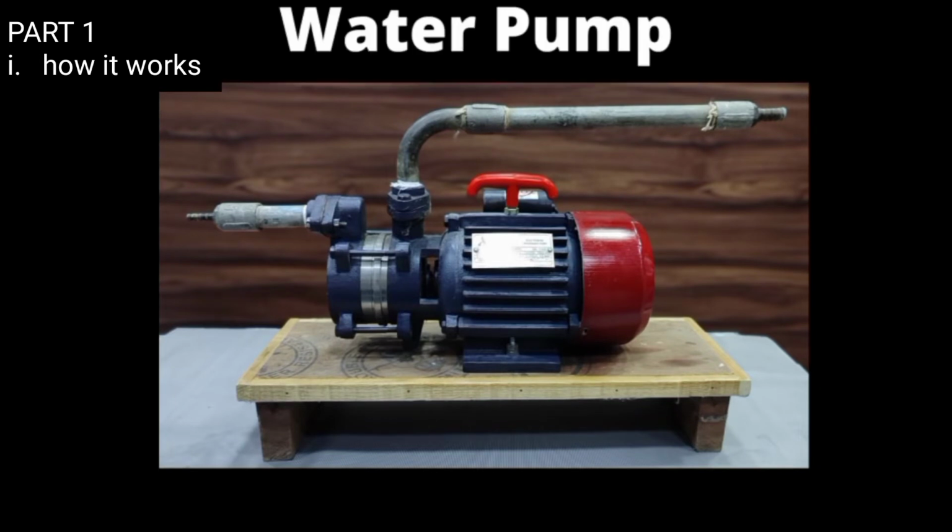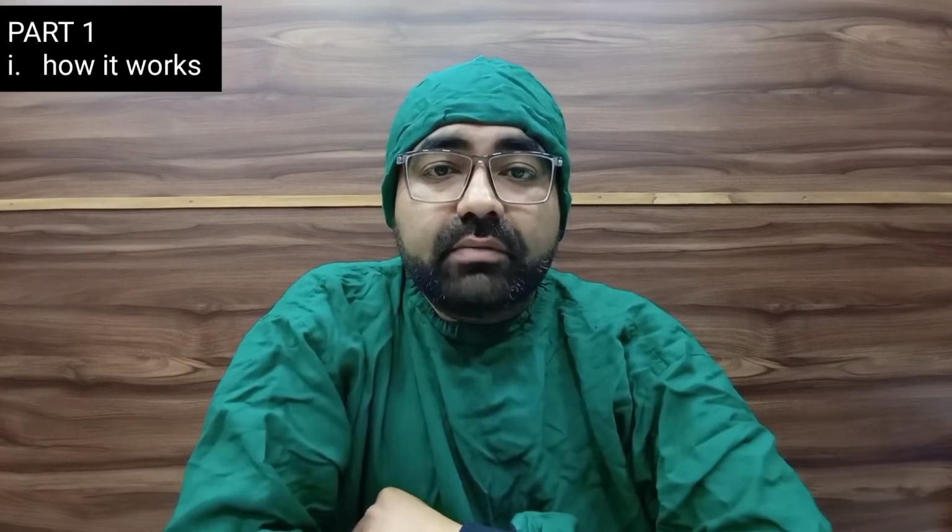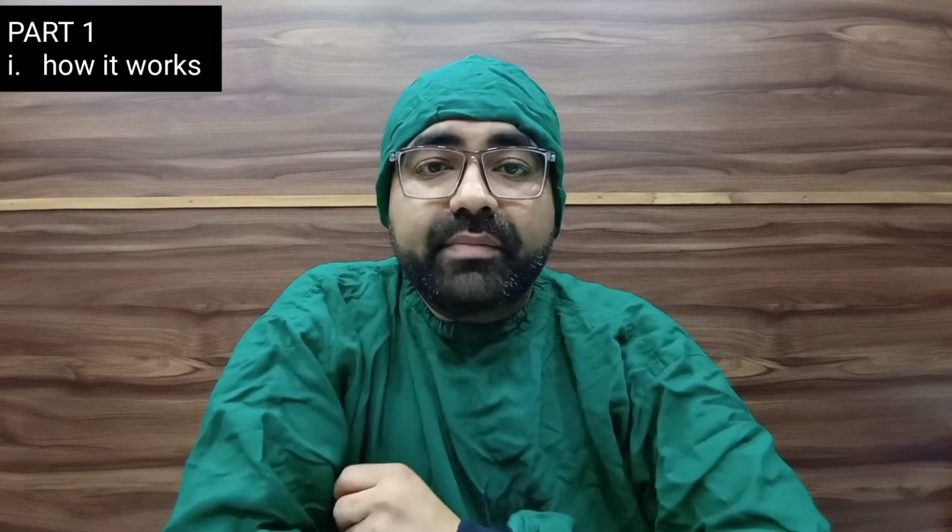Yes, it is the same electric water pump that you have in your house and which is used to push the groundwater to your terraced water tank. Any water pump works on the principle of sucking any liquid from its one end and pushing the same liquid with force to the other end. And same is the requirement for our dental suction.